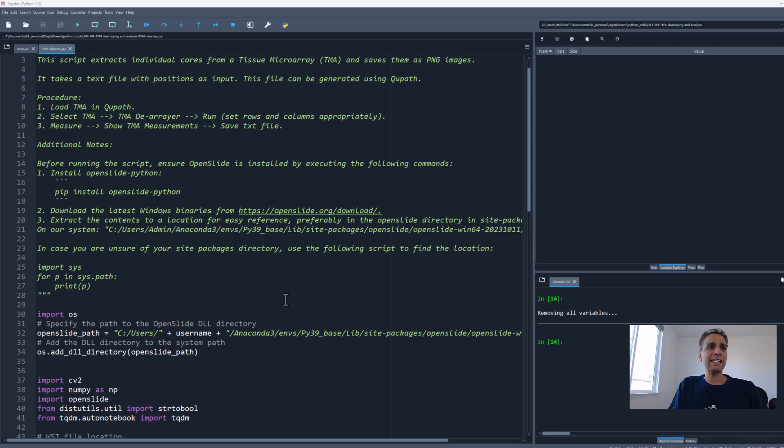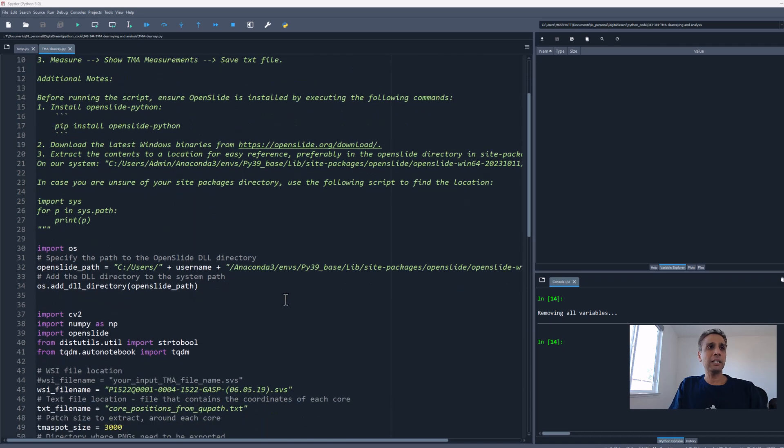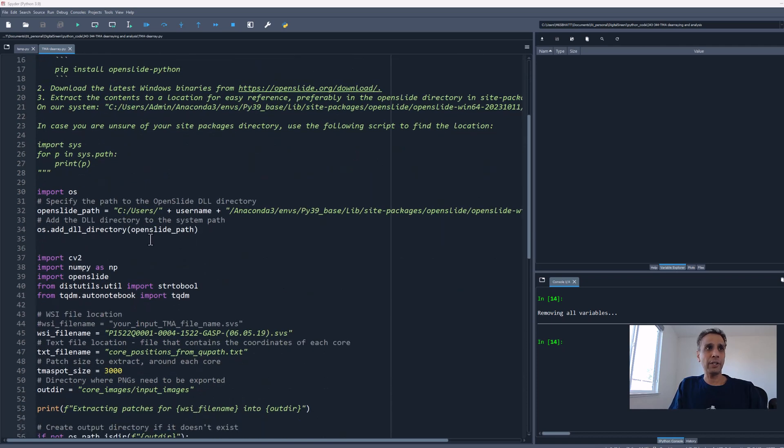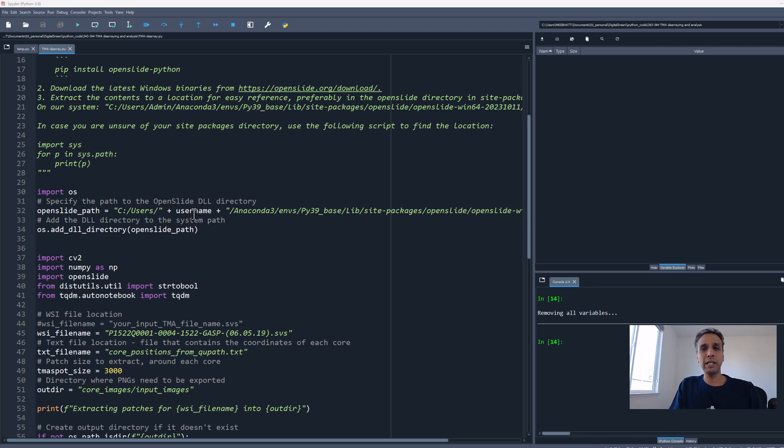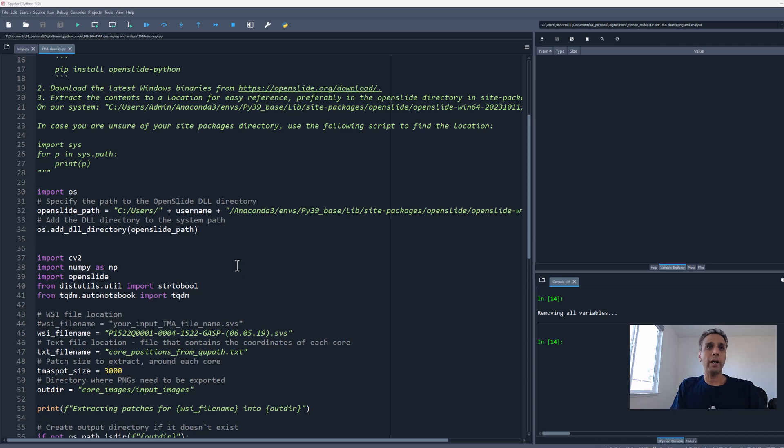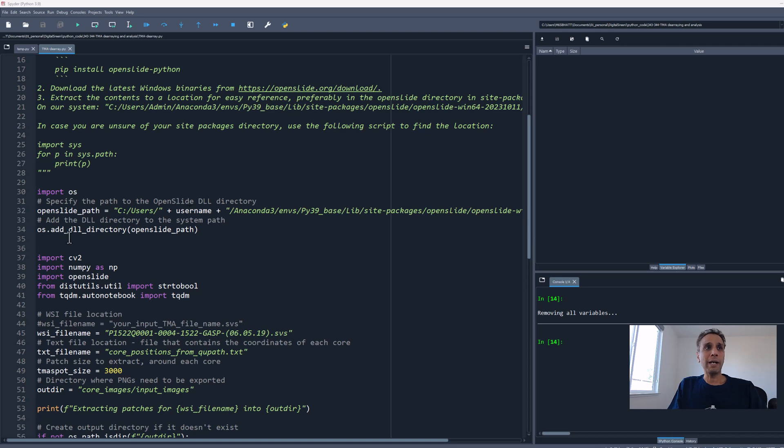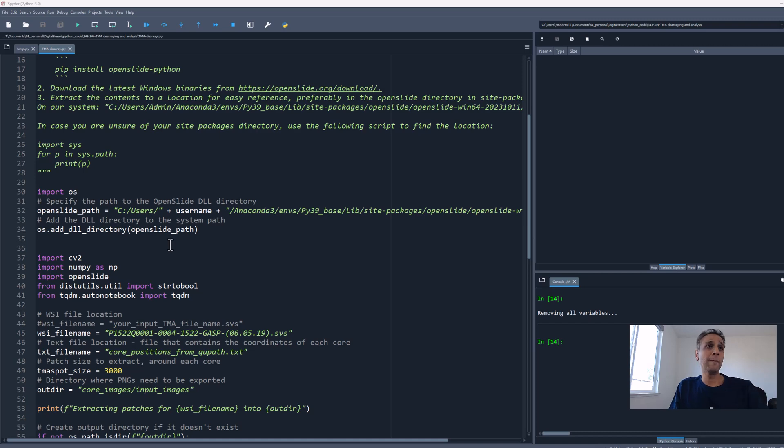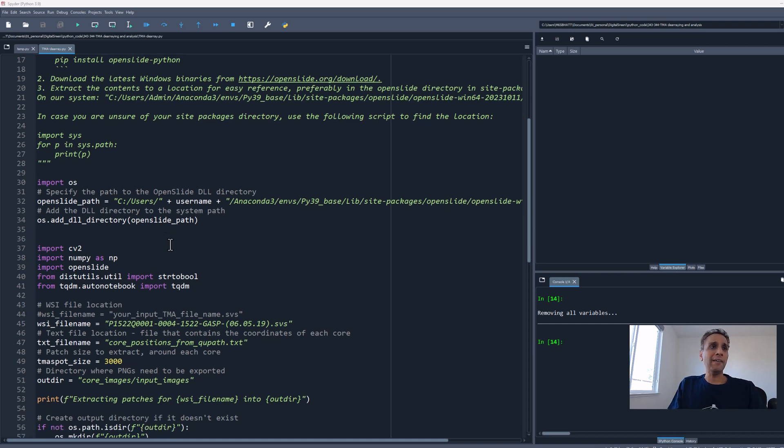Usually it's in C Users Admin Anaconda3 Environments. This is where I stored it along with the OpenSlide library. That's the path you provide when you set the OpenSlide path. I used a variable username because I use the same code on different systems. Once you have this path, it knows where the DLLs are located and should hopefully work.